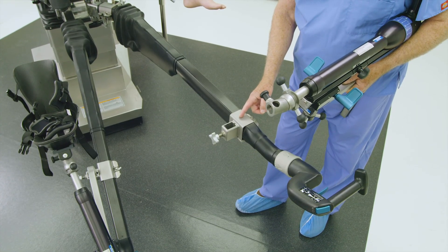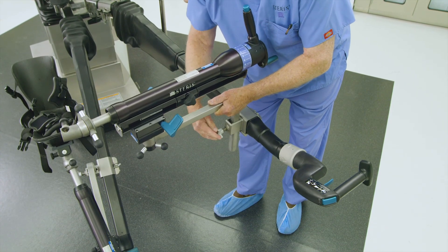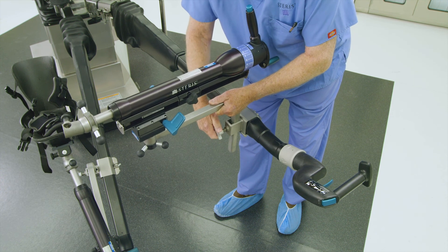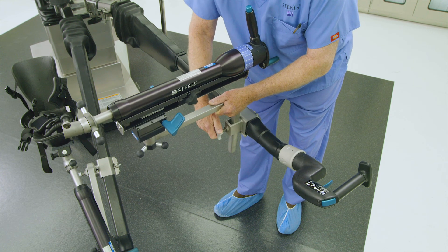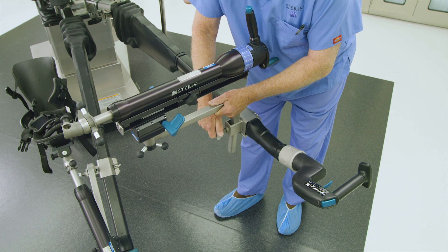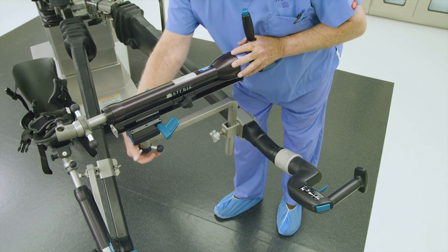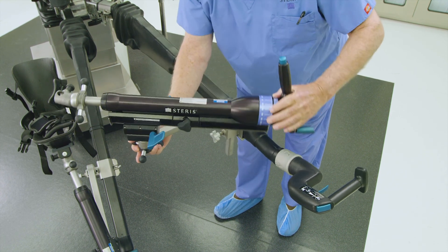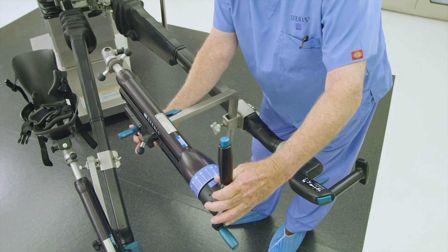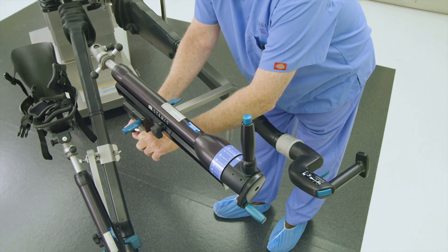On the non-operative abductor spar, reset the L-shaped bracket in the spar clamp to a 90-degree horizontal position so that the L-shape is pointing toward the operative leg. Loosen the knob below the gross traction slide and pivot the traction assembly 90 degrees and into alignment with the patient and the operative leg.